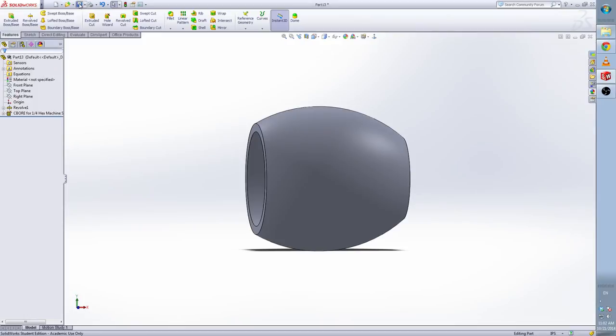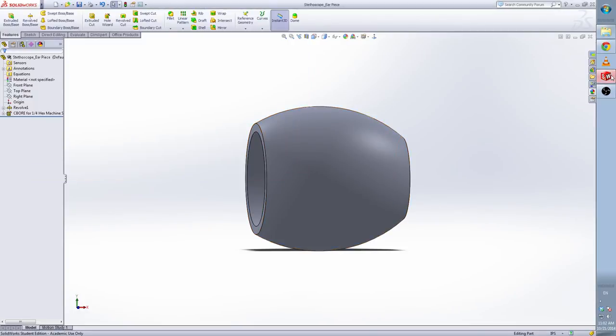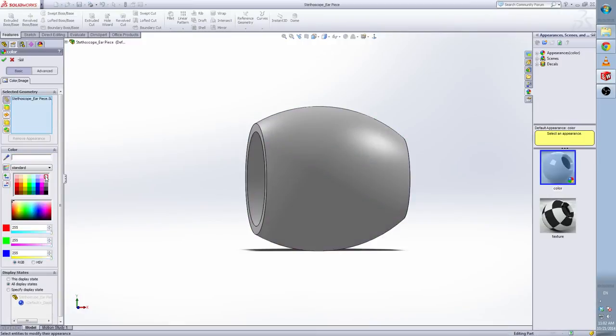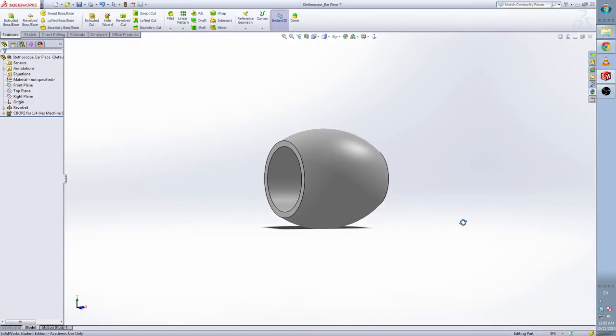Now we save this. The name is 'ear piece'. Change the color to white. Save.